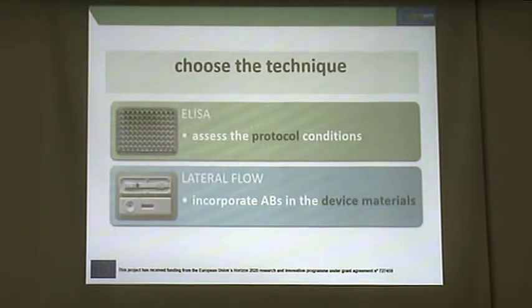The two techniques we have chosen in our project are the ELISA and the lateral flow. When we deal with an ELISA test, the development process consists basically in the development of the assay protocol. The protocol is the core of the assay development.